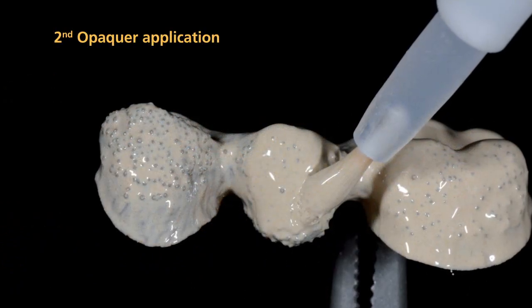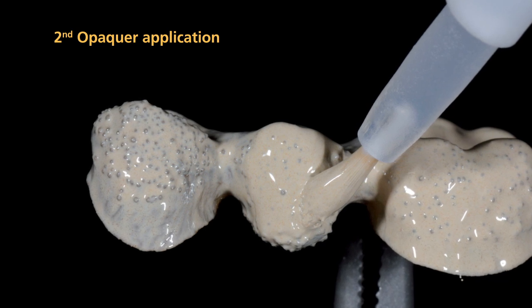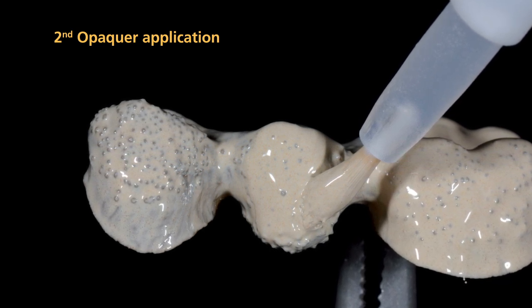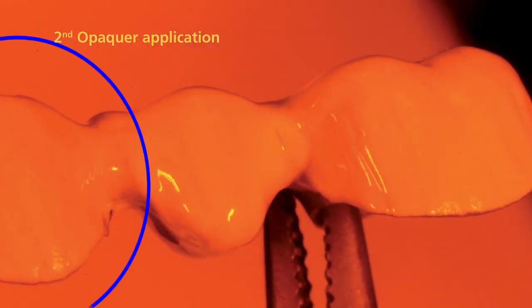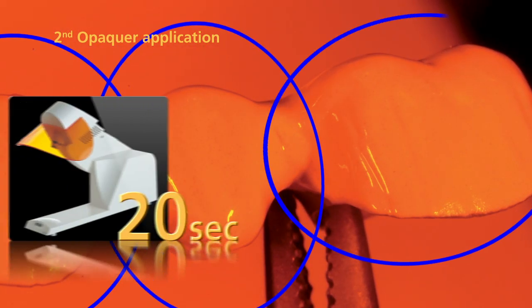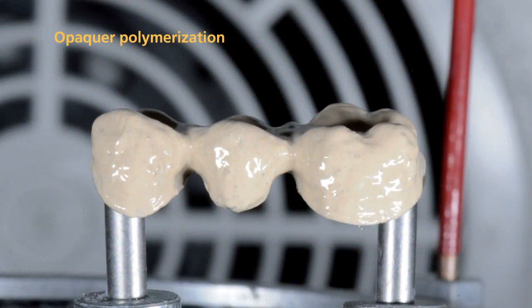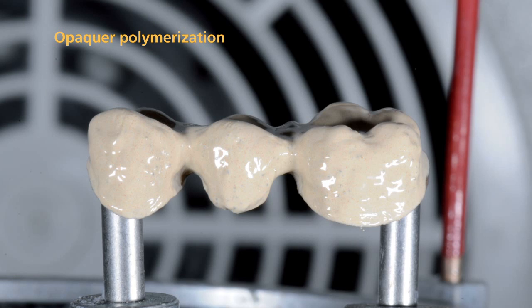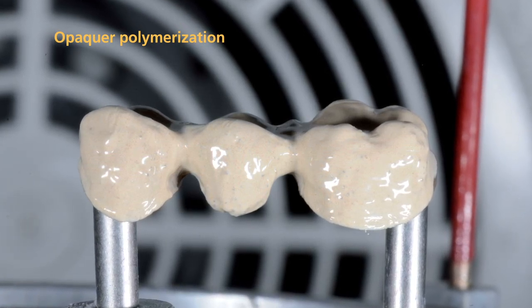Apply the second layer of Opaquer in such a way that the metal framework and, above all, the retention beads are now entirely and fully covered with Opaquer. Subsequently, pre-cure each segment again for 20 seconds using the quick. Conduct the final polymerization of the Opaquer in a Lumamat light furnace for 11 minutes using program P2.